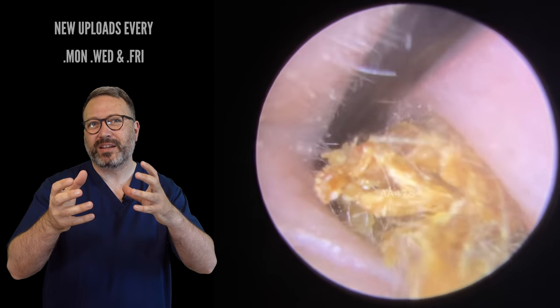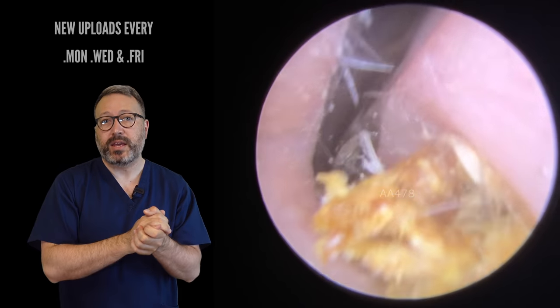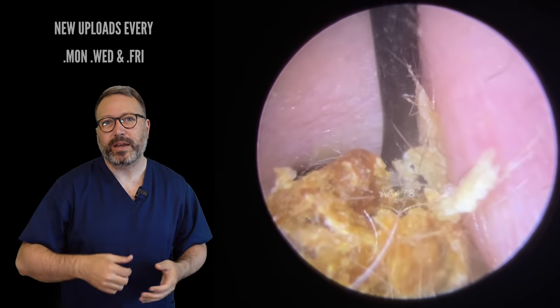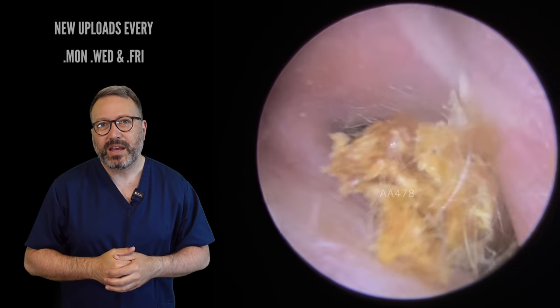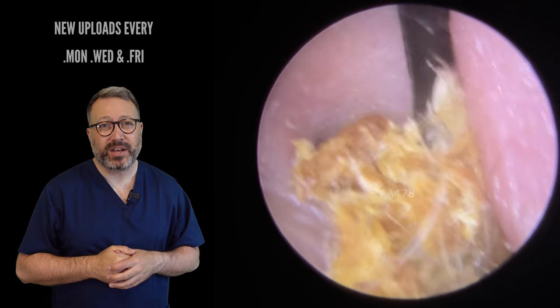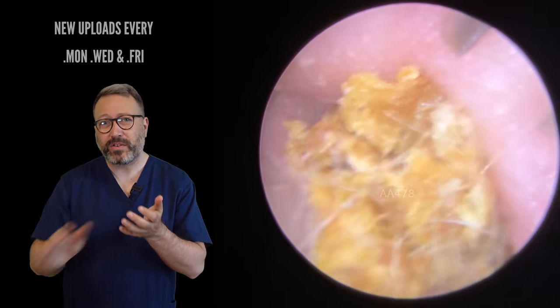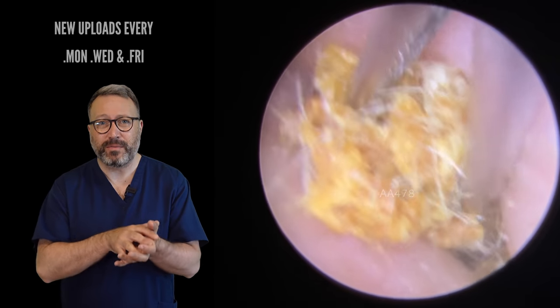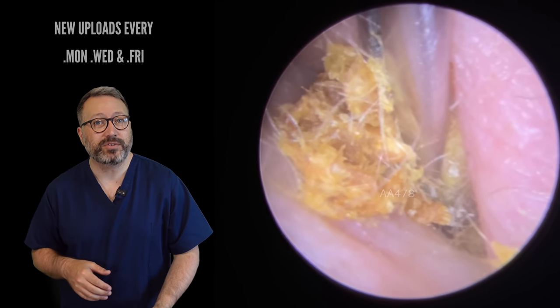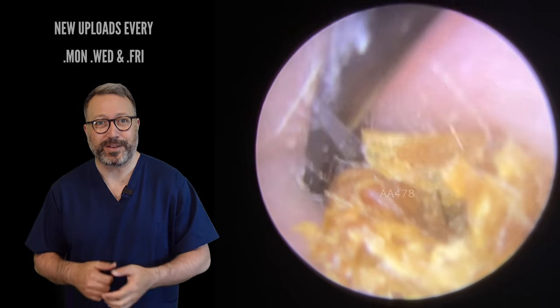When it starts to loosen like this, you've got the thin end of the hook just pulling through. Obviously when you're using a curette such as the Jobson horn, it's got that nice wider surface that'll get behind it really easily and pull it forward. But even this is so, so tough on this side. The patient has been using a bit of olive oil, but the surface had just got so hardened up that the olive oil didn't impregnate into it. So we've got the crocodile forceps in here now — quite a range of tools on this one: suction, St. Bart's hook, Jobson horn, and crocodile forceps.